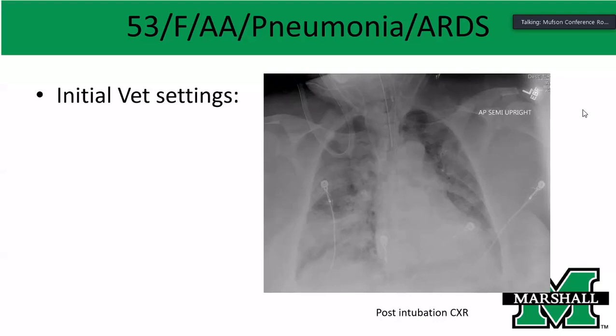Okay, so the main thing is the pulse oximetry, how hypoxic the patient is. Patient is desatting in the 60s because you just intubated the patient and the X-ray looks bad. So when the RT looks at you, the RT does not want to hear "depending on hypoxia," right? Just give me what you're going to answer the respiratory therapist. Say them now. Okay, we start like 100% FiO2. We can put like 10 PEEP.